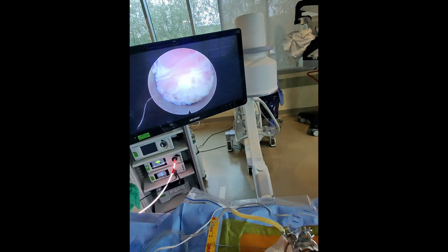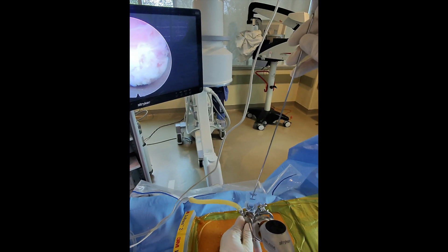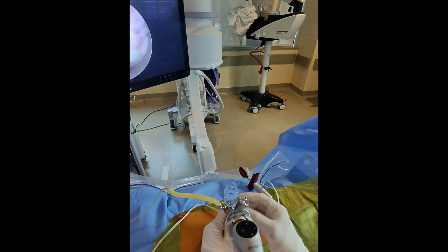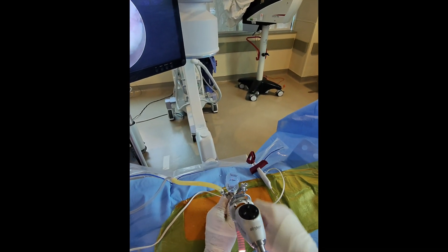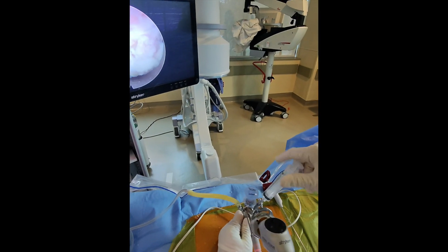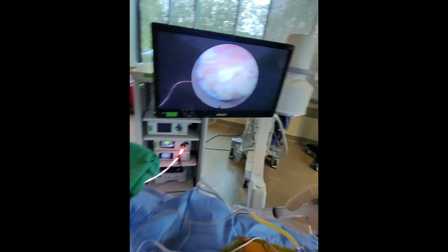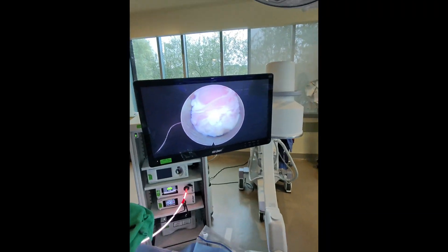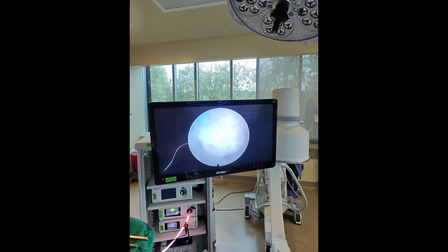Now we have essentially a semi-closed system. If we insert a relatively small-diameter tube into the passport, the fluid will bubble around it. We can also control the fluid by turning this stopcock on and off, but this is only a 1-millimeter port so it will plug frequently — which is why you need a 20cc syringe on the table to clear the debris that accumulates in that port during drilling. I've found this gives a much greater degree of hemostasis because it increases the pressure in the wound, and the vast majority of my cases have no significant blood loss.